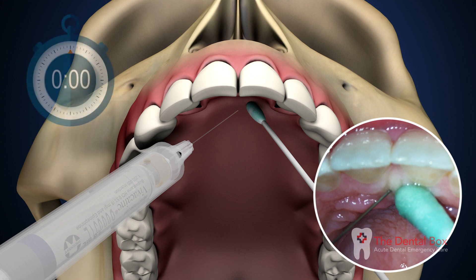Aspirate syringe. If negative, deposit one-fourth of a cartridge over 30 seconds.